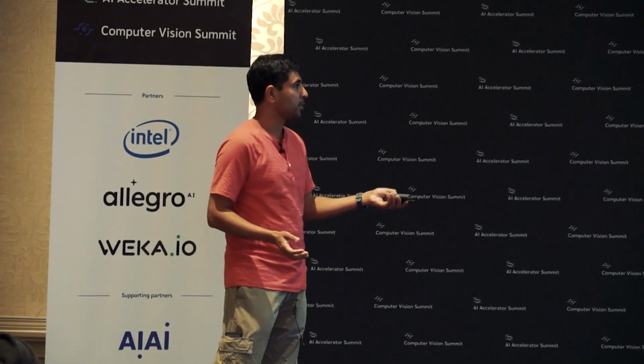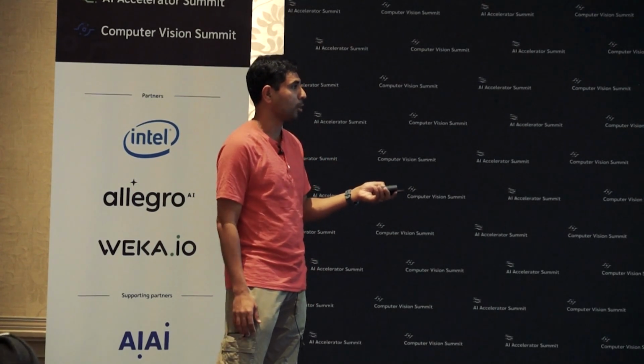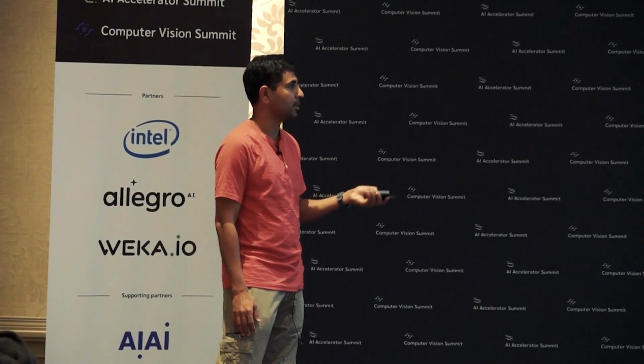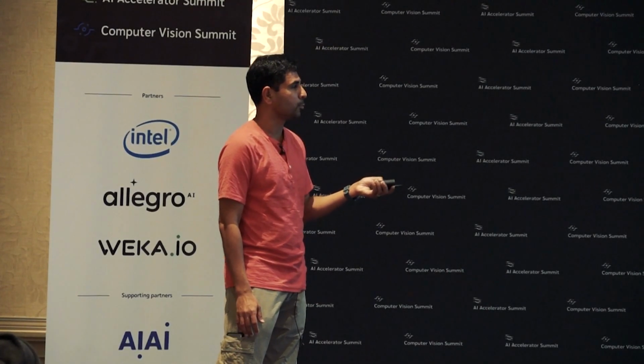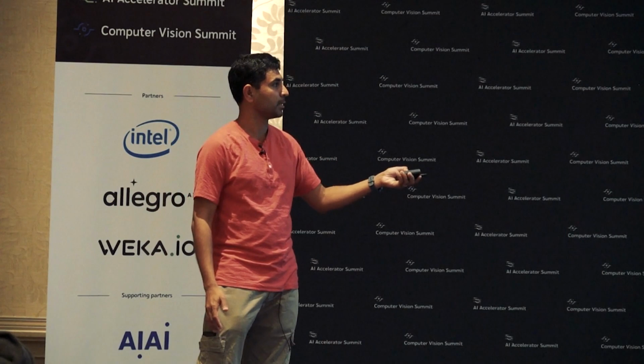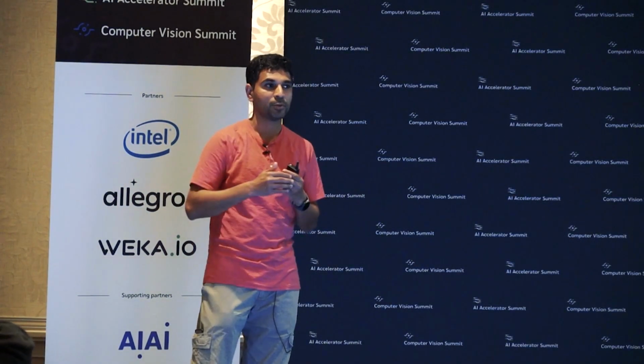And the paper that came out on top in this particular challenge used something called an EndoNet, which was, I believe, a VGG backbone. So they did it in a 2-step process. They used the CNN to break down the video into single frames, and every frame they featurized. So the EndoNet was essentially outputting a feature vector, and that was fed to an LSTM, which was looking as far back as 30 seconds.